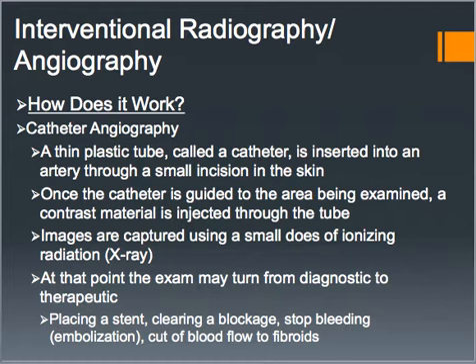So they'll make that incision, they'll put the catheter in, you center that x-ray right over it, and then as the doctor slowly advances that catheter into the artery, the x-ray machine follows it all the way to the area of interest. Once the catheter reaches the spot the doctor wants to see, they inject contrast through that catheter. That contrast allows the doctor to see the blood vessels in that area or assess for any abnormalities, such as a rupture, aneurysm, or clots. And the whole time they're capturing images, so they can save images just like a normal x-ray using ionizing radiation during that procedure.